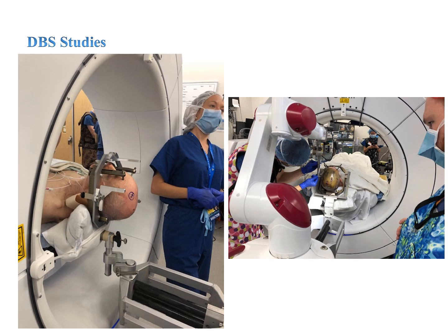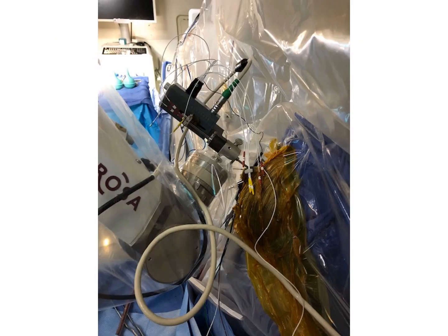In terms of our recordings, a lot of our efforts revolve around the creation of a neuromodulation system appropriate for Parkinson's disease. We perform many of our deep brain stimulation lead placement cases in the operating room with patients awake that are interactive and able to undergo testing studies. We also use robotic guidance. You can see our ROSA robotic system with our Medtronic O-arm. We also perform both surface cortical LFP recordings along with microelectrode recordings in the subcortical structures at the same time.